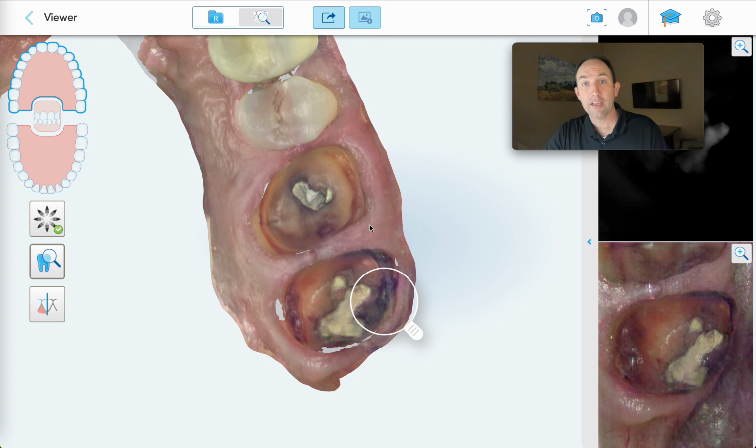So best case scenario, I'm going to treatment plan a root canal and a crown for you, patient. And we'll hope for the best when we get in there. There is some chance we may not be able to fix it, and if we can't fix it, we'll take a step back, we'll talk about options, and kind of go from there. How does that sound to you?